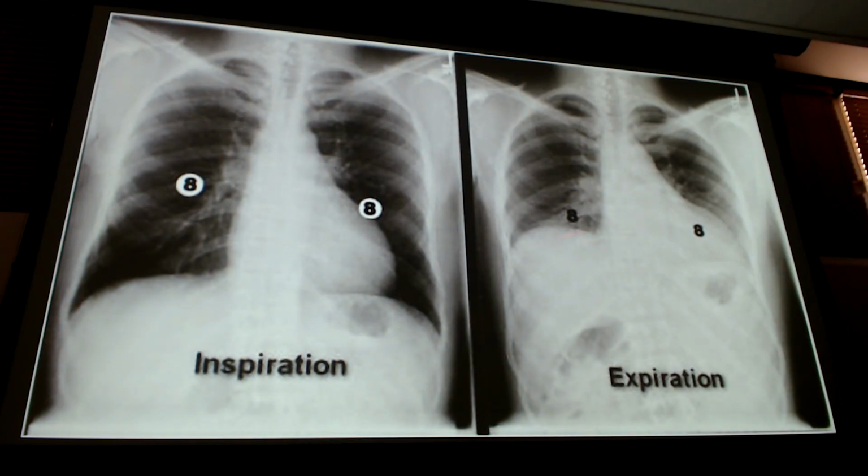See how the inspiratory and the expiratory look different? I'm not going to make you tell me expiratory is adequate. If you see an expiratory film on the exam, it's there because it's needed to help you make the diagnosis, and it will be adequate. You won't have to determine that.